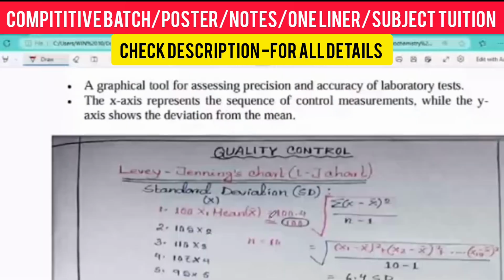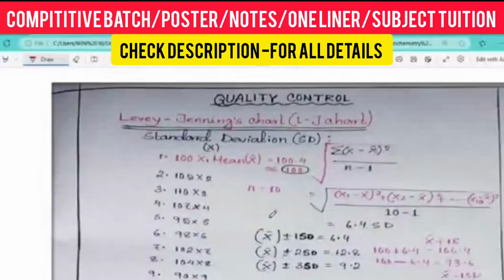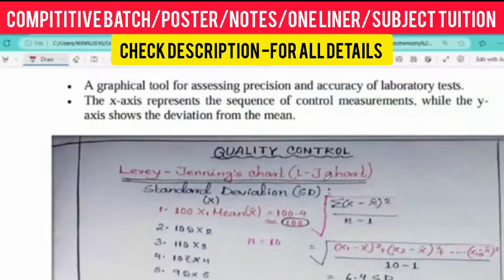Okay, now we are going to understand the Levey-Jennings chart. Keep in mind that I am saying this three times because it has a lot of importance. The Levey-Jennings chart is the mother of clinical biochemistry. Without the Levey-Jennings chart, you will not be able to get any result in your laboratory. Getting my point? The Levey-Jennings chart is the mother of quality control. It is the core part of clinical biochemistry.